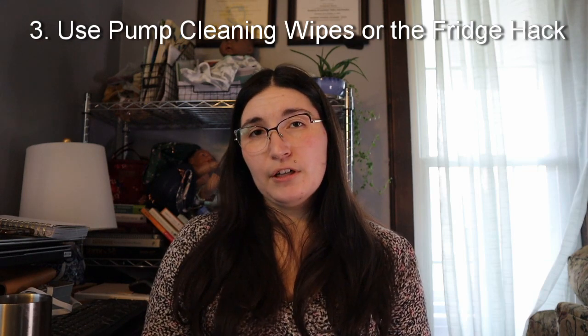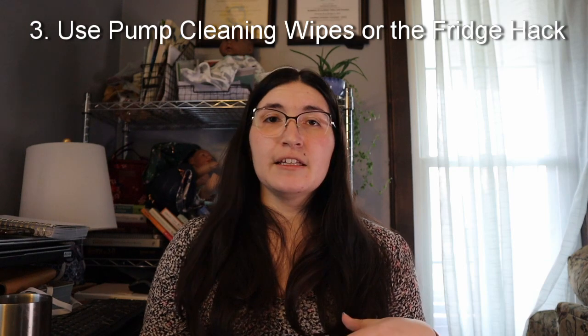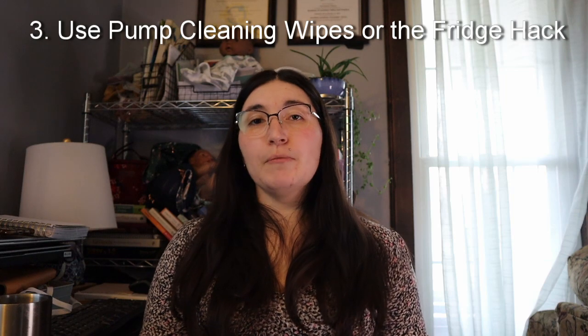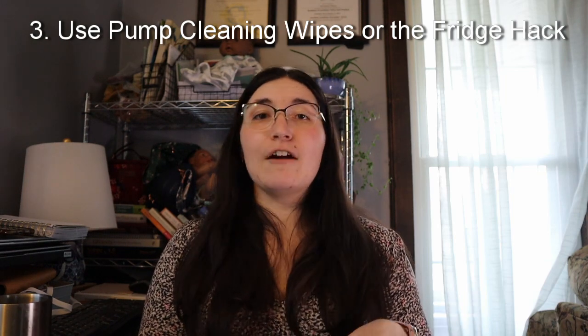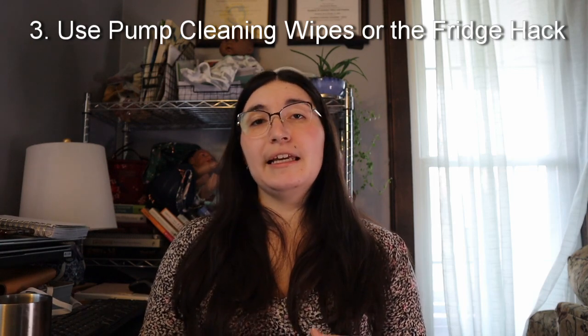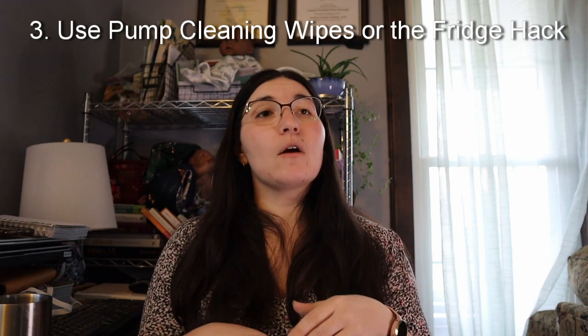Now, an alternative to buying pump cleaning wipes is to do the fridge hack. So the fridge hack is when you put your milky collection kit after pumping in a wet bag or a zipper plastic bag and put it in the refrigerator, or a cooler bag with an ice pack. So you can use a wet bag, the wet dry bag, to keep your collection kit in. Just stick them in there, zip it up and stick it in the fridge.